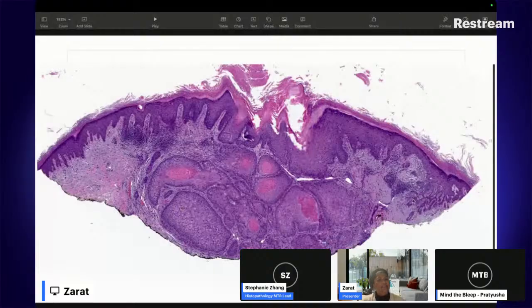Here as well in the epidermis, that looks a bit abnormal to me. And again, the epidermis is much more thickened, and it looks like something is going on there. So you can have abnormalities in both the epidermis and the dermis, and in this case, I think that is what we're dealing with. Any sun damage? You can see this nice bluish purplish sun damage here on both sides. So we have lots of sun damage.